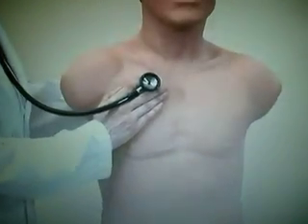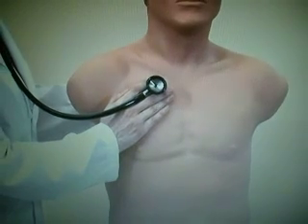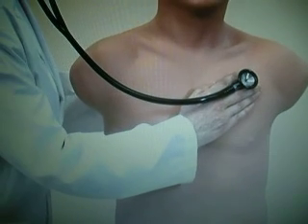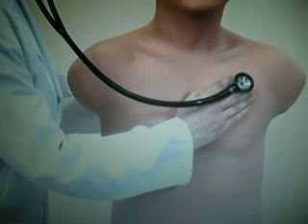Using SAMView Sounds display system, you can see the phonocardiogram of severe aortic stenosis. Simultaneously, you are hearing this sound as heard at the aortic area. Note that the murmur is throughout systole, with late peaking ending at S2. When the stethoscope is moved to the pulmonic area, the systolic murmur is still heard, but not as loud.